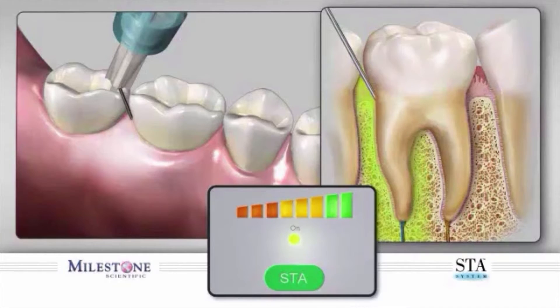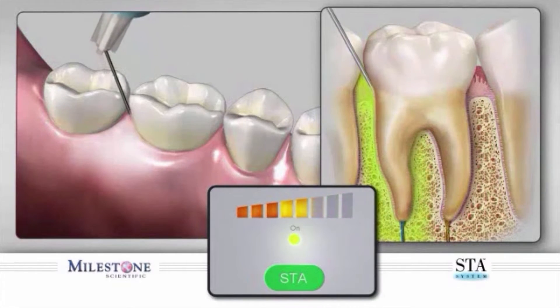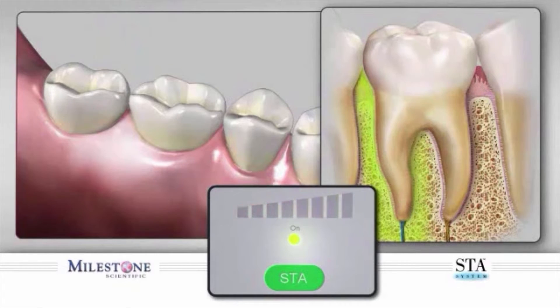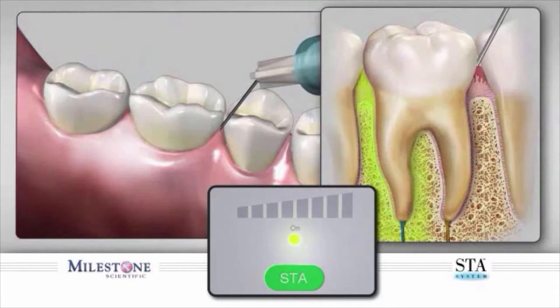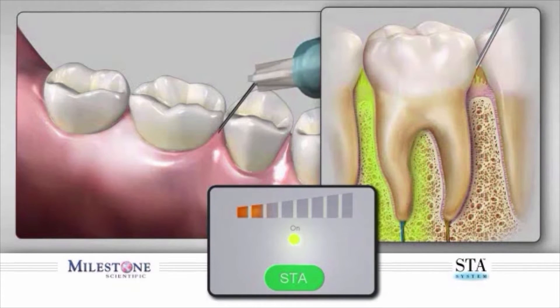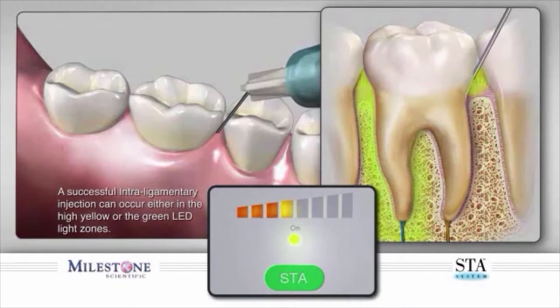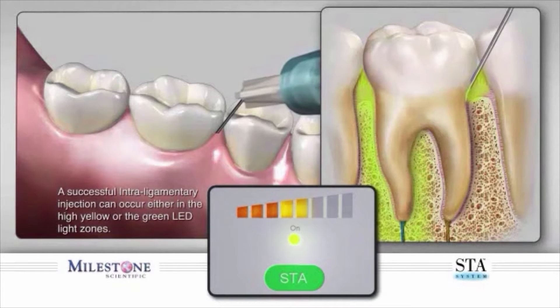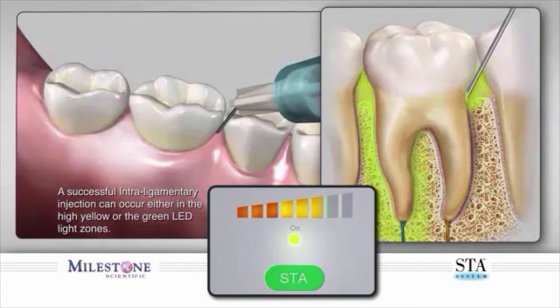After 20-30 seconds with the needle located in the correct location, you will hear the wand system announce PDL-PDL. This will be followed by a series of two longer beeps indicating that the proper pressure is being maintained and that you have identified the correct needle position. Insert the needle on the mesial root of the molar. It may not be necessary to bend the needle to gain access on the mesial. Take care to insert the needle with the bevel facing the surface of the root. Slowly advance the needle into the sulcus until resistance is felt using a 45-degree angle.